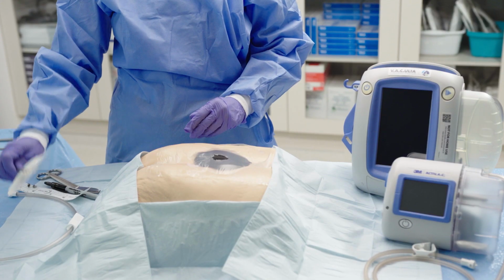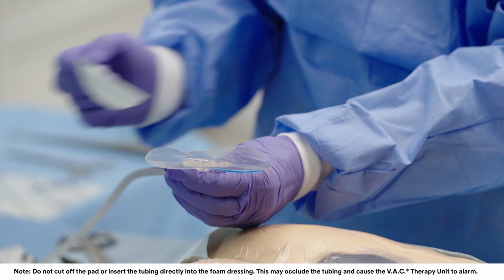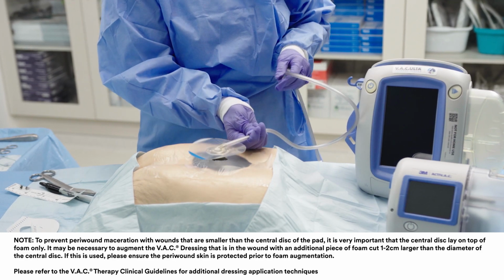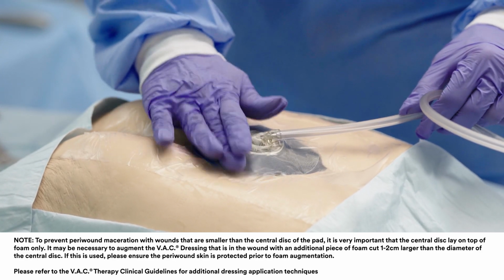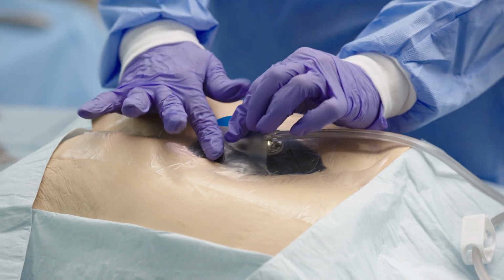Apply the pad, which has a central disc and a surrounding outer adhesive skirt. Remove both backing layers 1 and 2 to expose adhesive. Place the pad opening in the central disc directly over the hole in the drape. Apply gentle pressure on the central disc and outer skirt to ensure complete adhesion of the pad. Pull back on the blue tab to remove the pad stabilization layer.